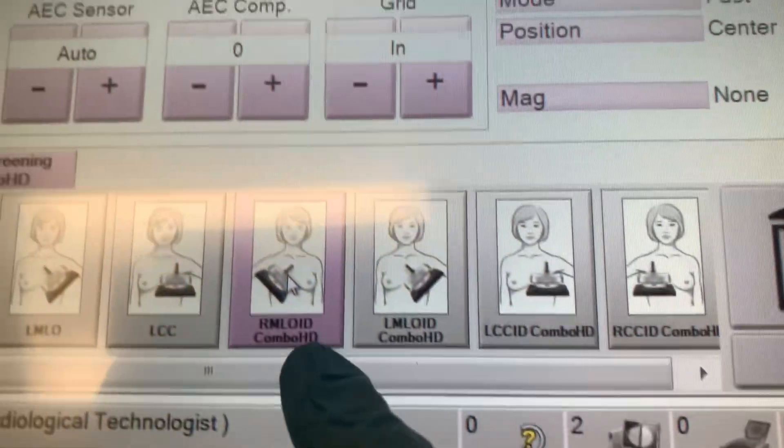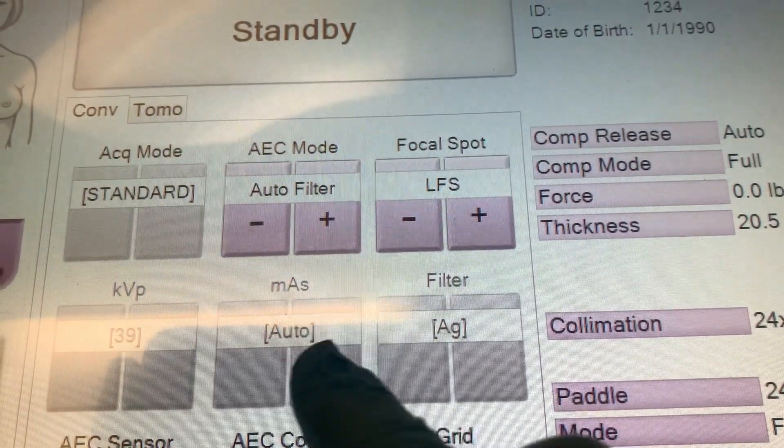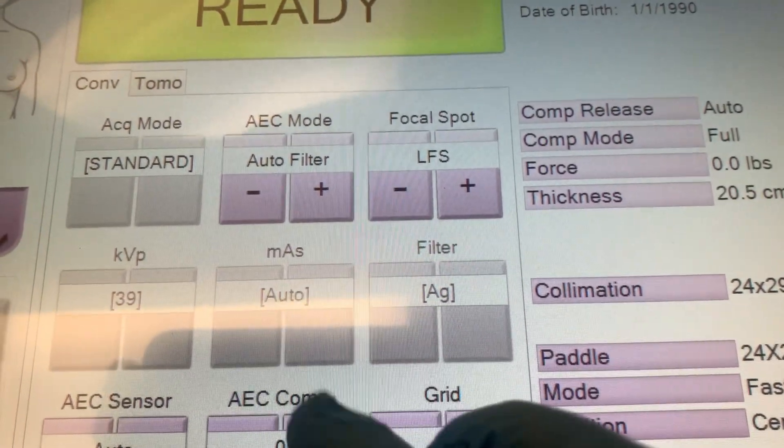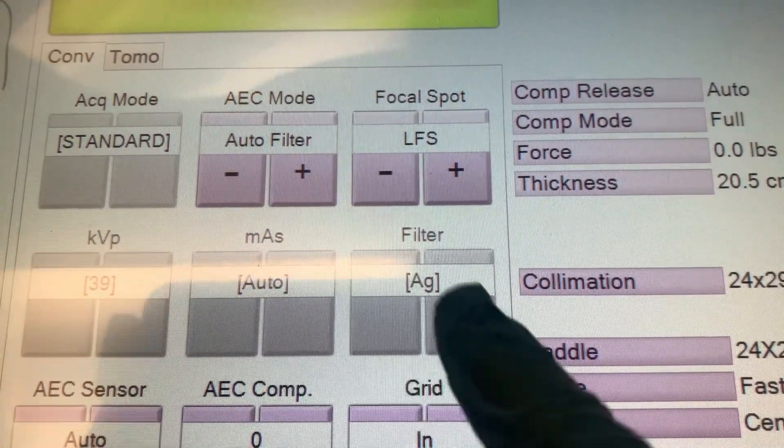So for your combo, this is going to be set with the automatic with AEC filter. So no mAs setting for that one. And you see how the filter changed.